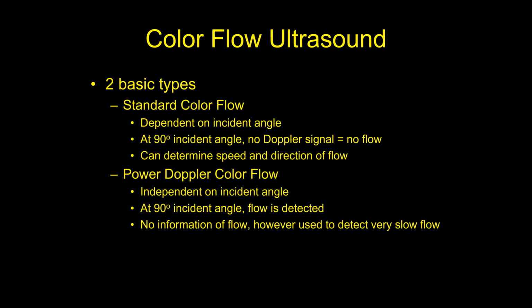So color flow ultrasound, again, is an option that the majority of ultrasound machines have. Some of the cheaper machines that you're going to buy, like with anything you buy, you tend to get what you pay for. And so some of the really cheap machines won't have color flow capability, and if they do, it's going to be really poor quality. But the majority of machines nowadays will have some type of color flow option that you can get.